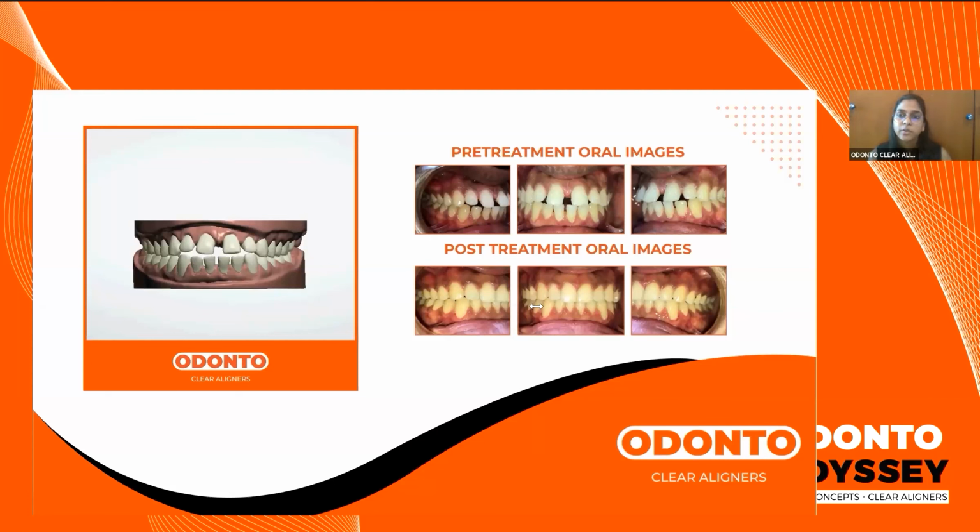In case you are progressing directly without the fixed bonded retainer, then we send the retainers to you. They will not have any attachments. Before the retainer is given to the patient, you will have to remove the attachments for the patient and then give them the retainer.